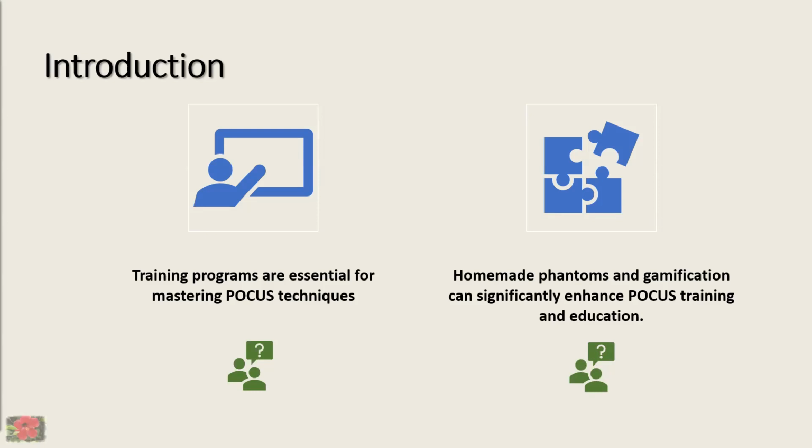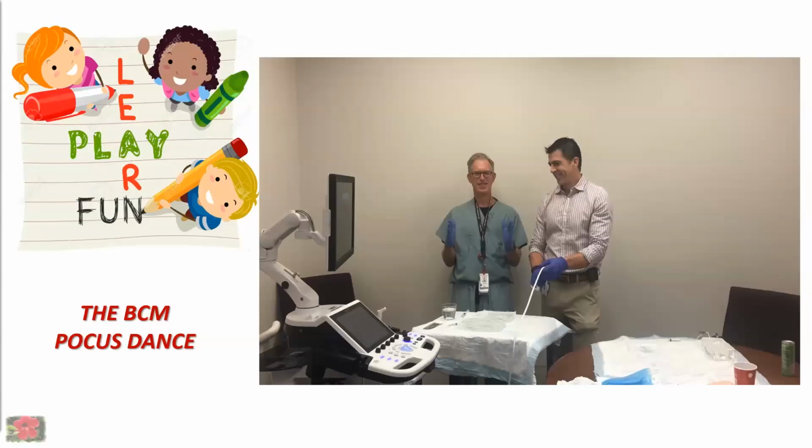I guess my one question is for the two folks who actually did make your own phantoms, what have you used? If people are willing to share. I'm April, University of Miami. I used Metamucil. It was a recipe I got off one of the Adult EM Docs websites. Awesome. Well, thanks, April, for chiming in, especially while you're driving. Drive safely.